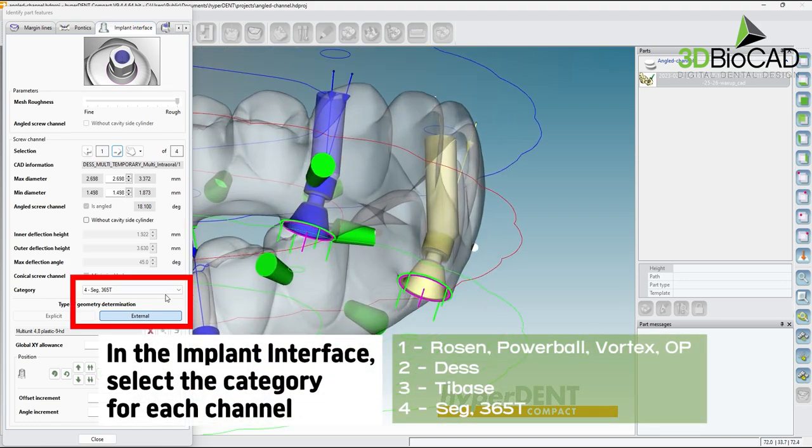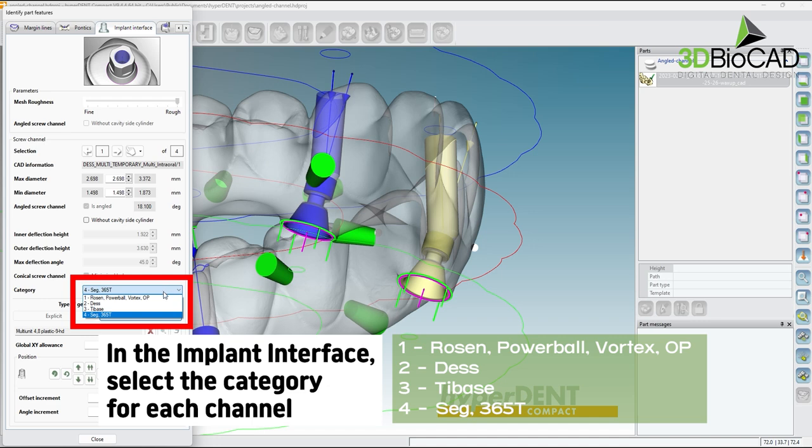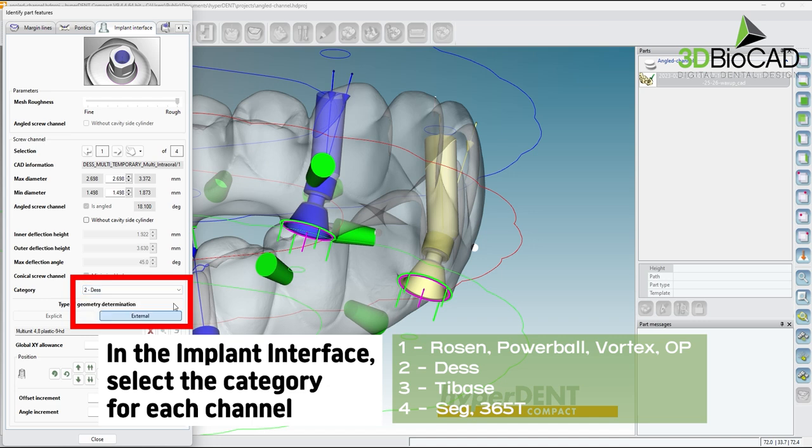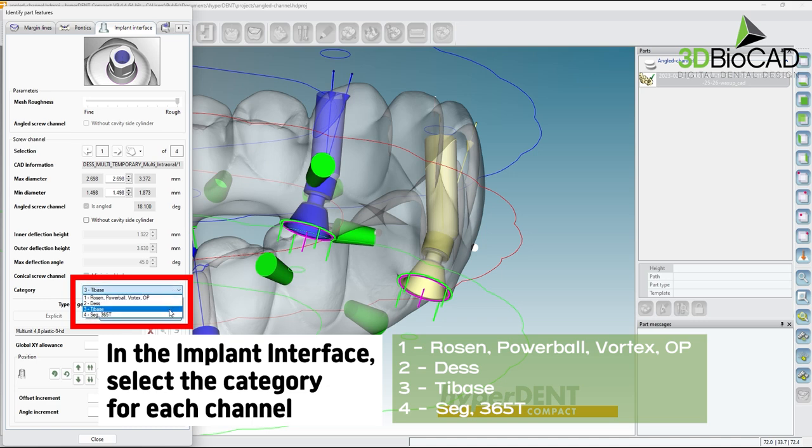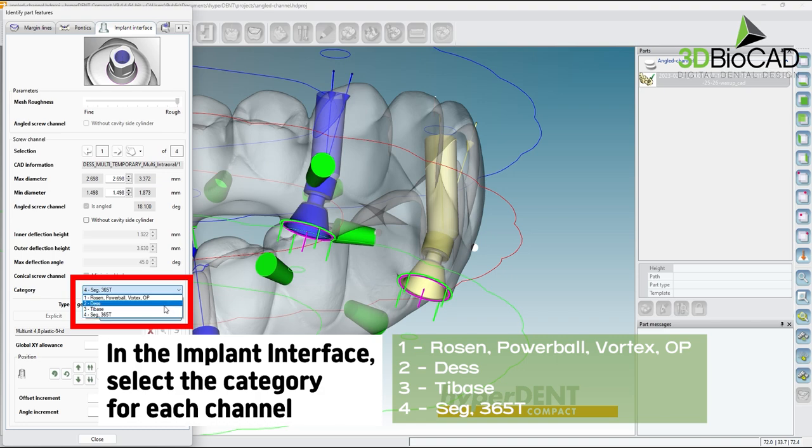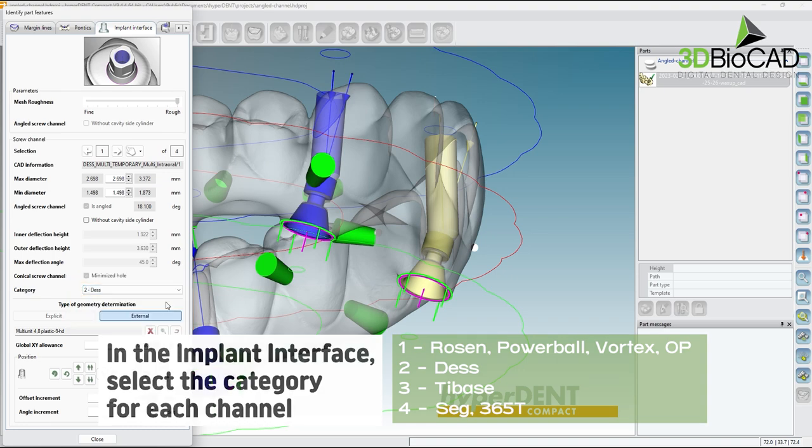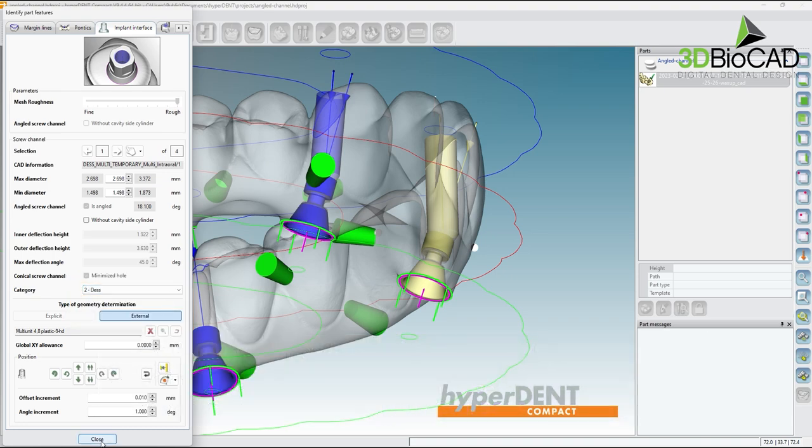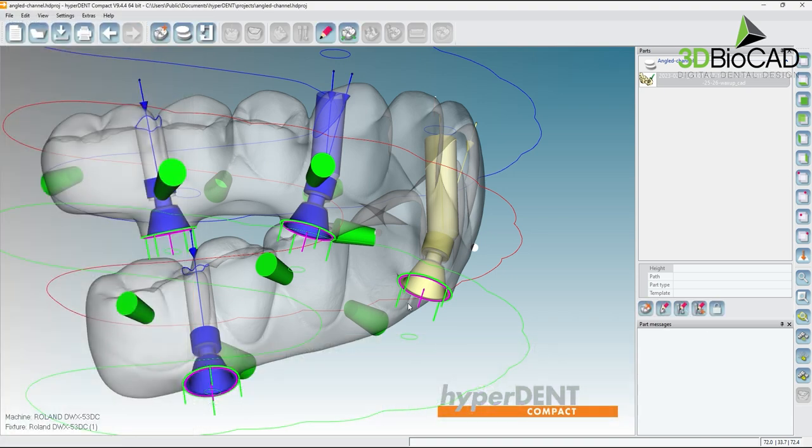Choose the interface type in the category dropdown and choose the appropriate category. The selected interface will show in blue and can be verified with the design file. This file can ensure consistency in milling angle and screw channels. Repeat this for all screw channels.